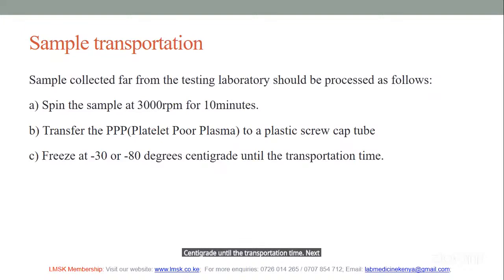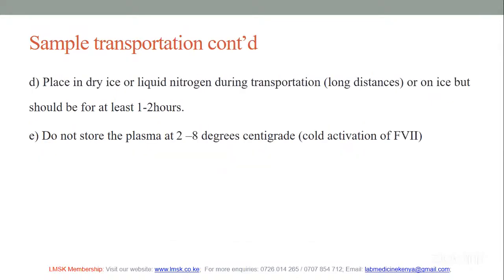Next slide, please. What you really need to do again is to place the sample in dry ice or liquid nitrogen during transportation. That is for long distances, or on ice, but it should be for at least 1 to 2 hours. Do not store the plasma at 2 to 8 degrees centigrade. That causes cold activation of factor 7. Next slide.